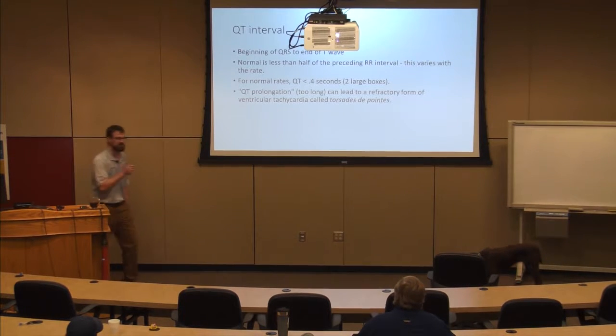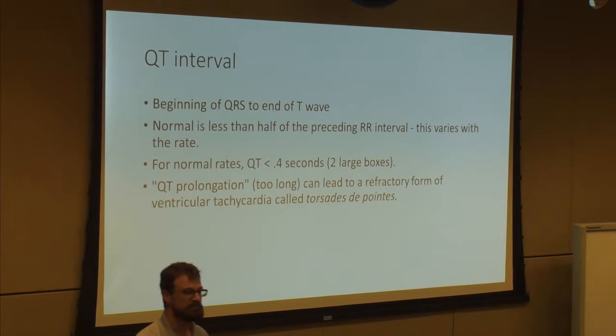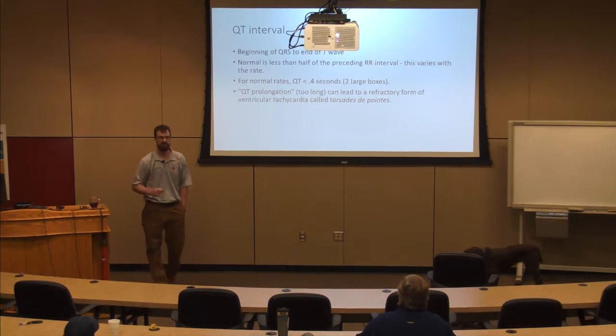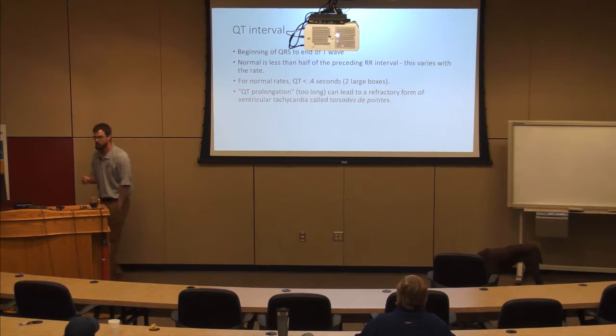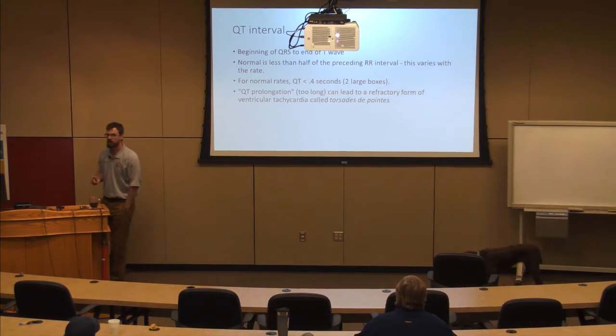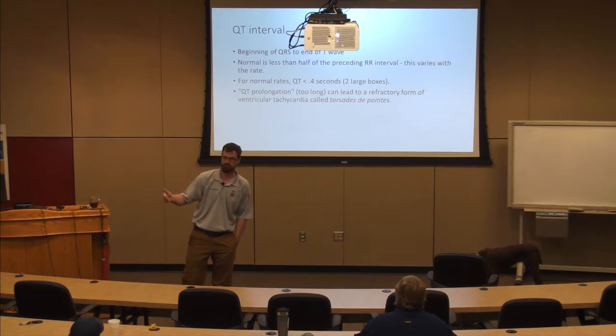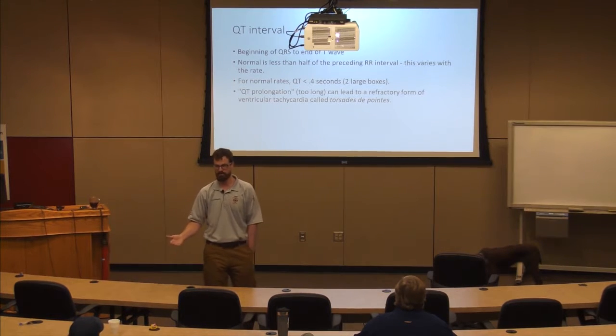The implications are different. What happens to wide QRS in the setting of sodium channel toxicity? Monomorphic tachycardias, okay? Monomorphic VTAC. By and large, they'll precipitate into VTAC, okay? We can anticipate that and treat it with sodium bicarb. QT prolongation is a sign of impending torsades, which we typically treat with magnesium, okay?